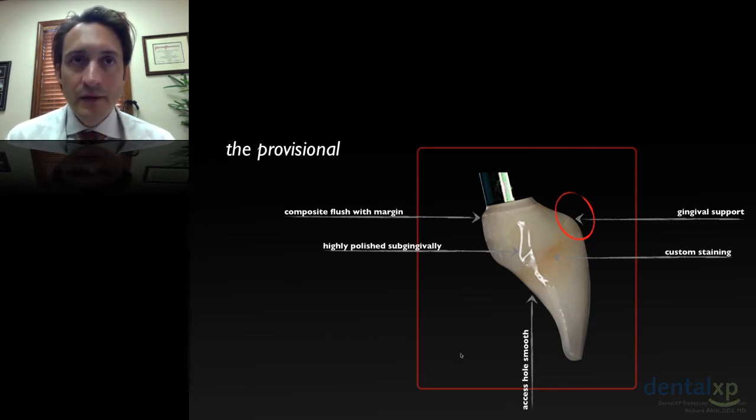I am not concerned in this area because this is an area that I want under contoured, and this will allow for more tissue volume, allow for maybe some graft material, whether that be connective tissue grafting or even some of your bone graft particles, which will be incorporated into this coagulum and can allow us to have a better gingival margin thickness and stability, I feel.